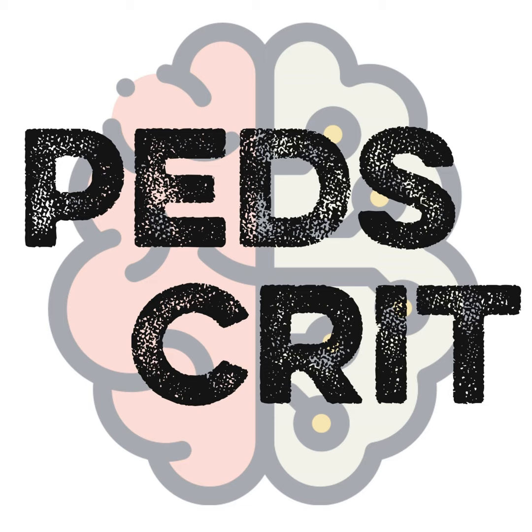And I said LA vent. Are there any other procedures that are available for our patients who are peripherally VA cannulated to decompress the left side? Sure. An LA vent typically is placed in a central cannulation. But in a peripheral cannulation, typically we ask for help from our interventional cardiology colleagues, and then they go to the cath lab and they get a balloon atrial septostomy. Or if they do have a PFO that had not closed, then they do get that enlarged. So mostly it's through our interventional cardiologists who do that.